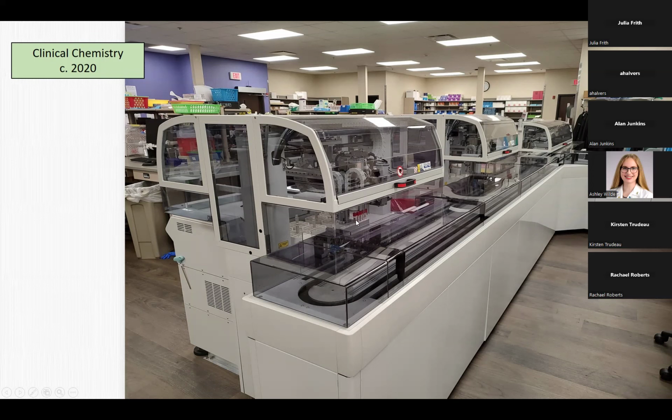It'll read the barcode. It'll know what tests have been ordered. It puts it on this cute little conveyor belt, which just runs around here like a racetrack. And then routes them on back here to machines that are this way. It'll put it right on the machine that's going to be used to run that test. So the people really are just kind of putting tubes on and then verifying the results when they come off the other end. They're not actually doing the chemistry here.